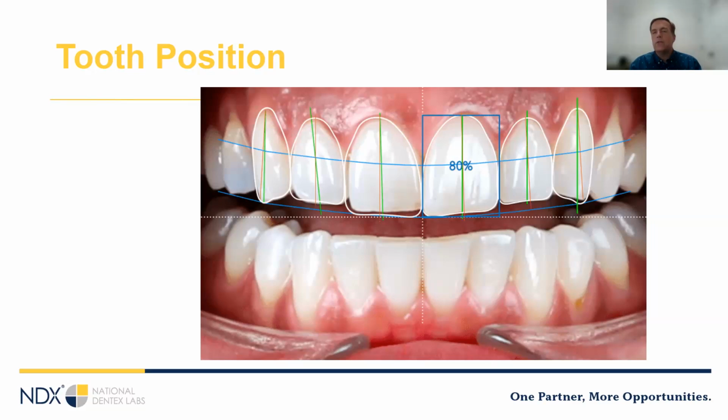If the patient wants the buccals of the maxillary anteriors overcontoured to support the lip, make sure that he or she approves the tooth design before manufacture. This kind of alteration puts an unsightly bulge somewhere in the buccal contour that can not only make the teeth look odd in profile, but it can warp the perceived ratio of length to width, making the teeth look kind of wide and ugly. So we want to make sure that we advise against it, but if the patient wants to do it, we need to make sure we let them see how those teeth are going to look before we go to final restoration.